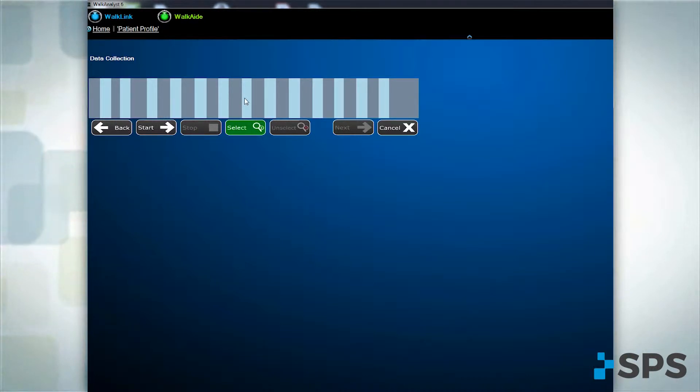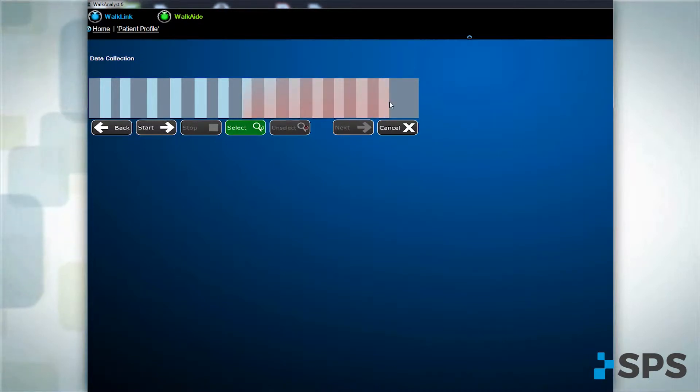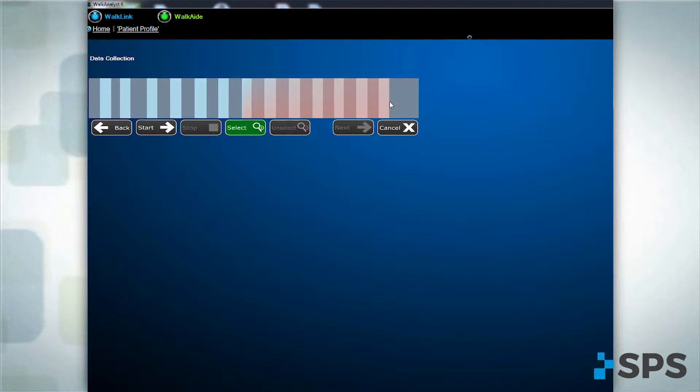Dark bars represent the stance phase of each step, during which there was no stimulation. By using your mouse to highlight a series of consecutive steps, you are selecting a sample representative of the patient's gait. Try to select 8 to 10 consistently spaced bars.